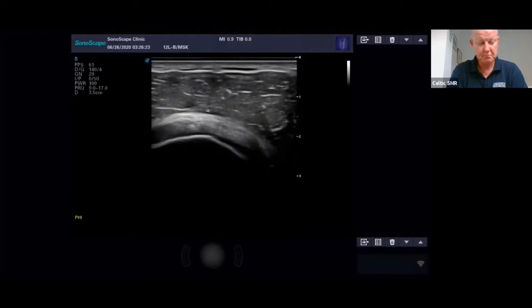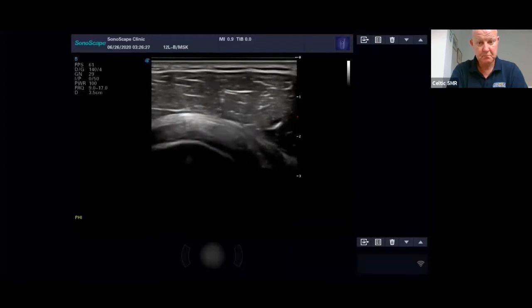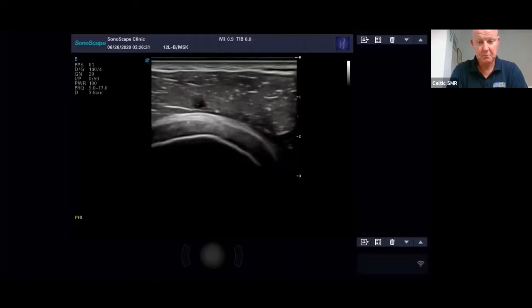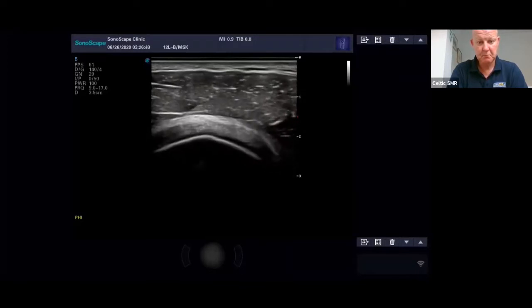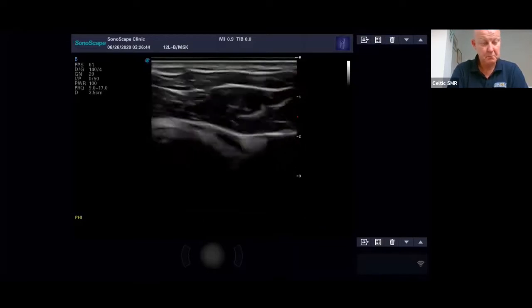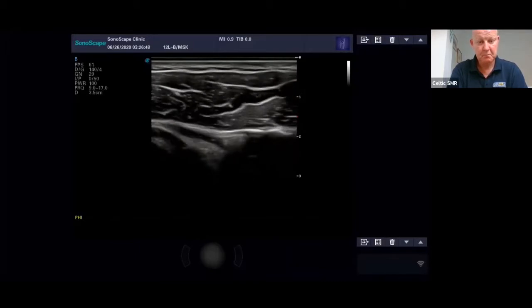Frozen shoulder is a bit of a clinical assessment, but there are some indirect signs that you can look out for. To be honest, I very rarely pick them up for frozen shoulder, but they are there sometimes, and that can be a thickened coracohumeral ligament, which runs across here.